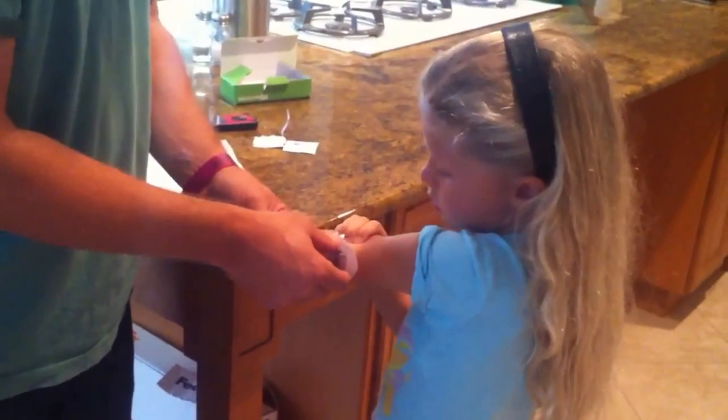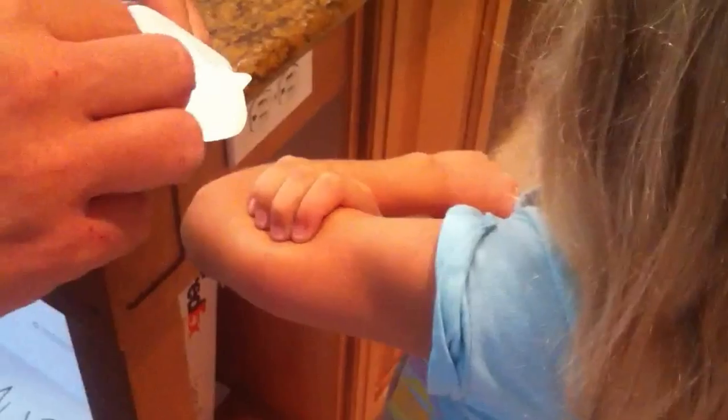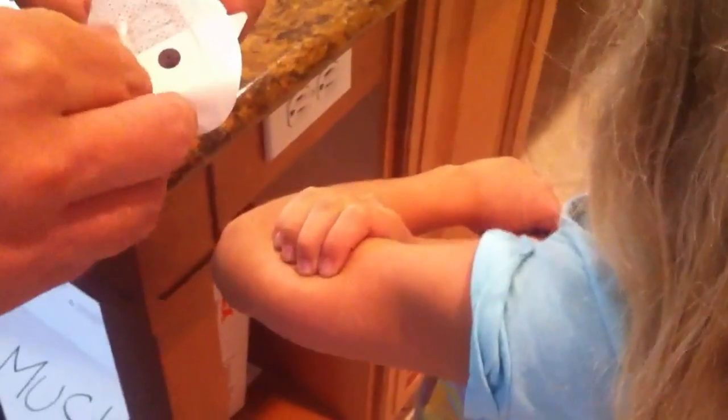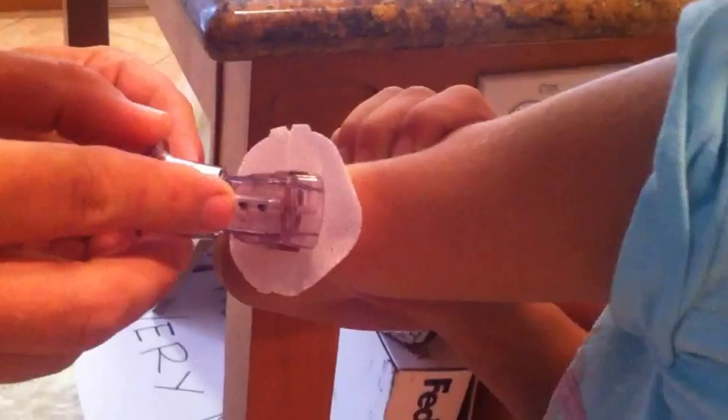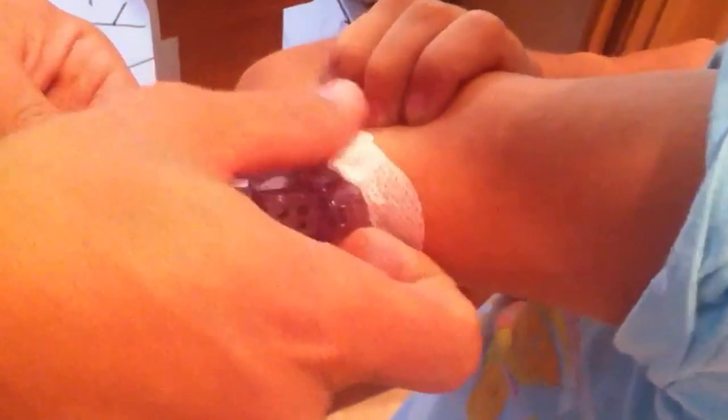Right there. Is that good? Okay, here we go. See the tricky part? I want to go higher. So what are you going to do, Daddy? First you've got to get it attached because it will stay on her for a week.